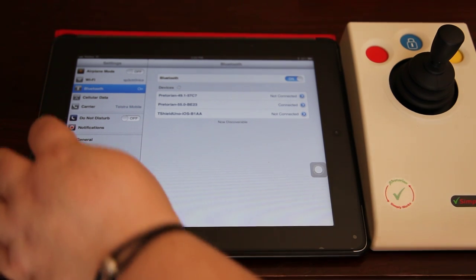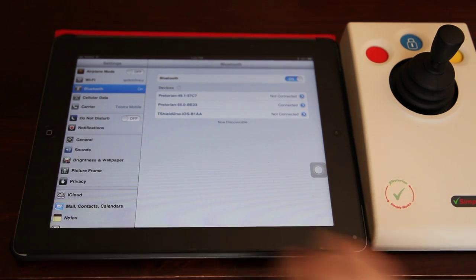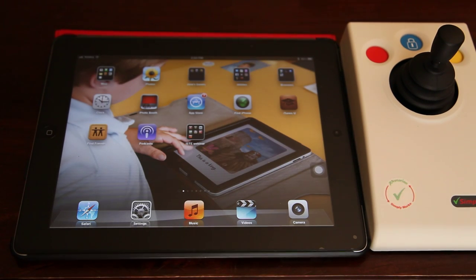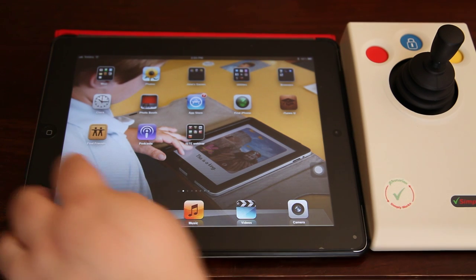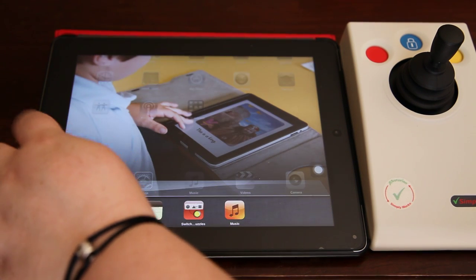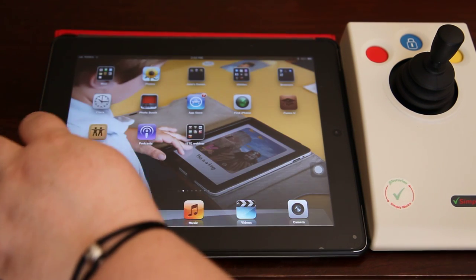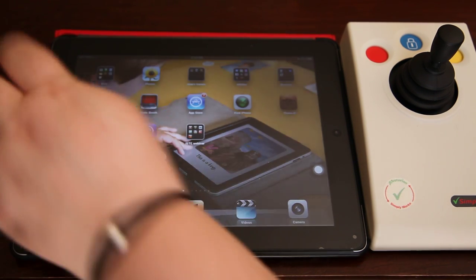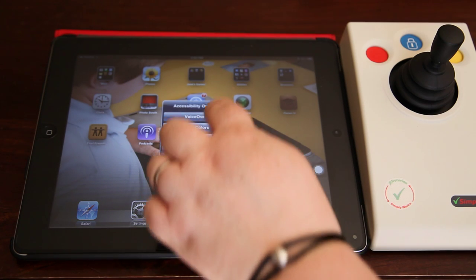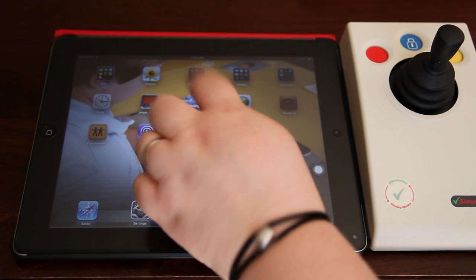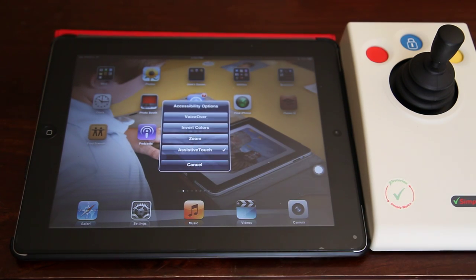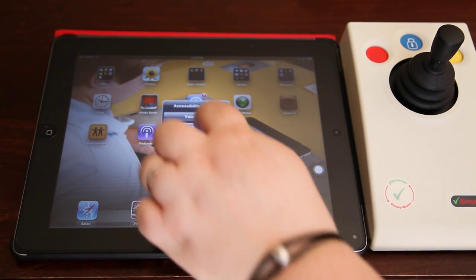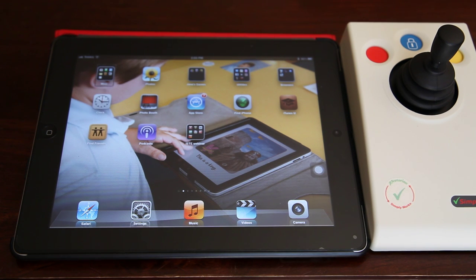The next thing I need to do is turn VoiceOver on. In my accessibility settings I have it set so that I just need to triple click home, and up comes a little menu of accessibility options I can turn on, and one of those is VoiceOver.